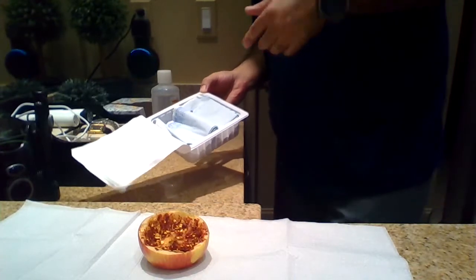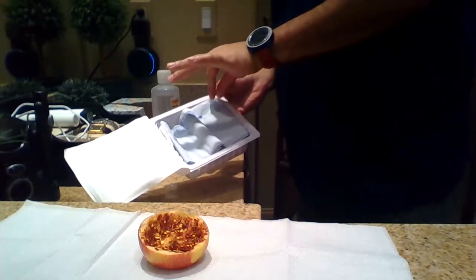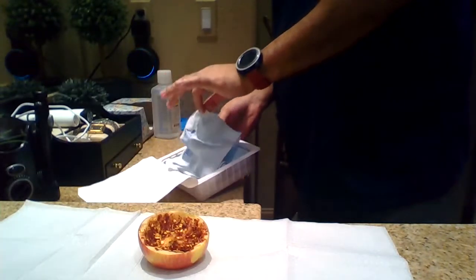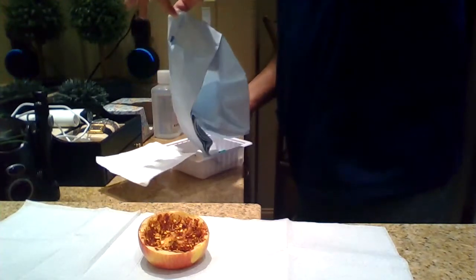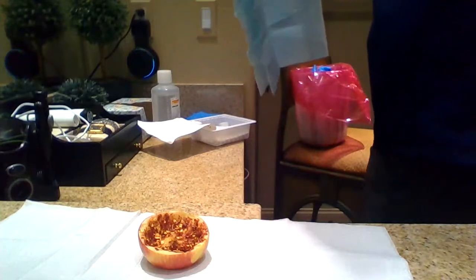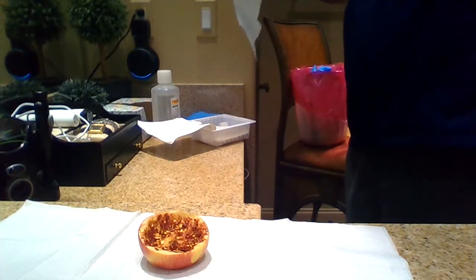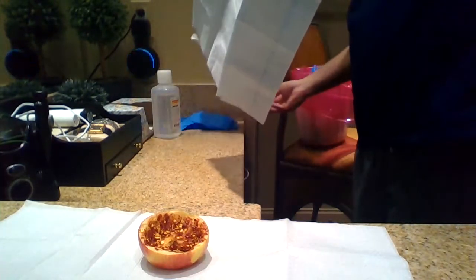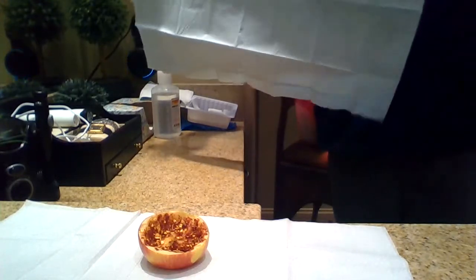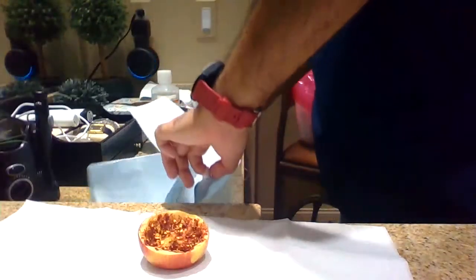So we have to keep in mind our 1-inch border. So it's telling us there that 1-inch border is there. So we only pinch it from there. And again, you have to keep in mind the sterile field. You're gonna keep in mind the sterile field. So again, you're allowed to only pinch the 1-inch border, and then you're going to lay your sterile field down.